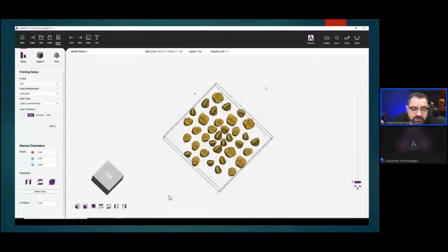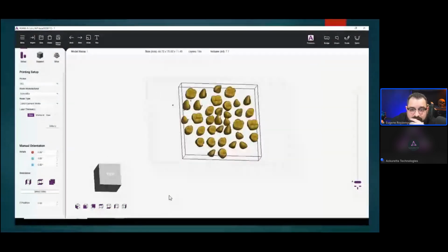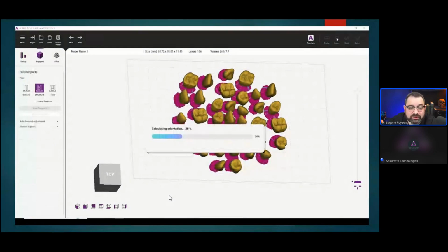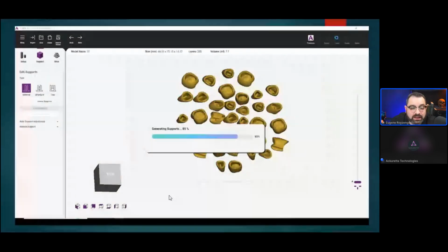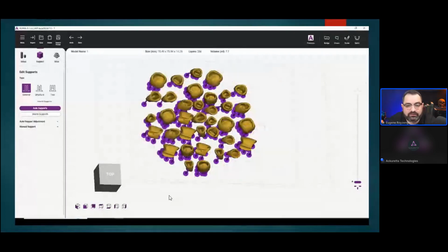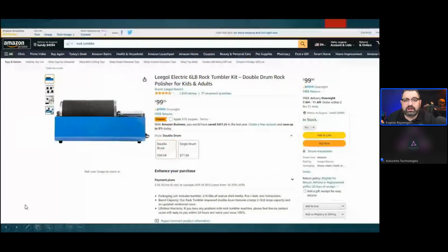With the AI option, I just bring the crowns in, activate the crown option, and it'll select them all. Press the crown option, and it'll go through and rotate each one of these to where they need to be and give you the proper position for optimal print for the crown. You don't have to sit there and rotate each one, and it goes pretty quick, which is a pretty cool option in my opinion. But it's up to you guys, whatever you want to do. What's great about the software is there's a free version of it, and then you have the add-ons that you can get from there. Okay, a couple of things I wanted to cover.